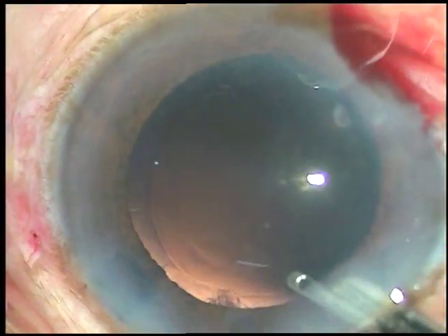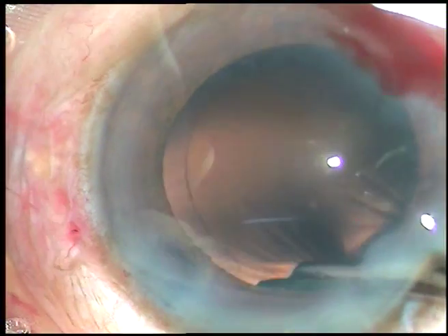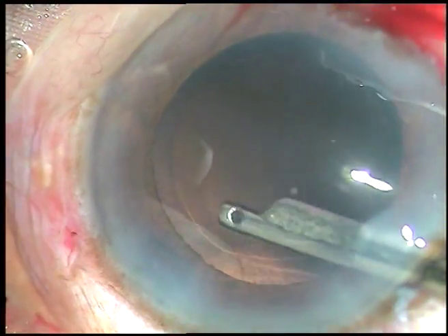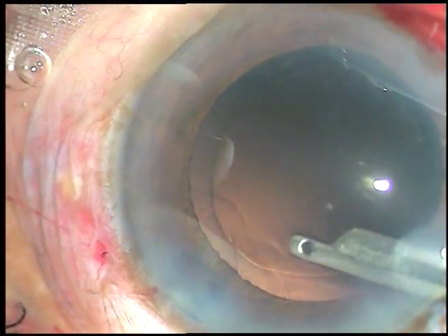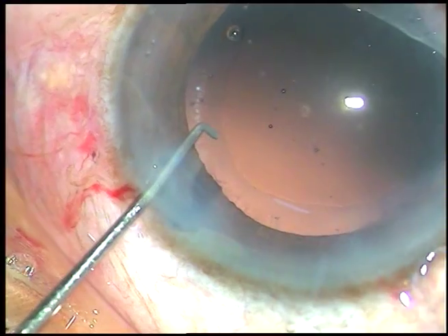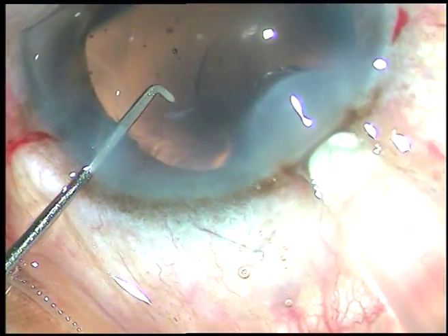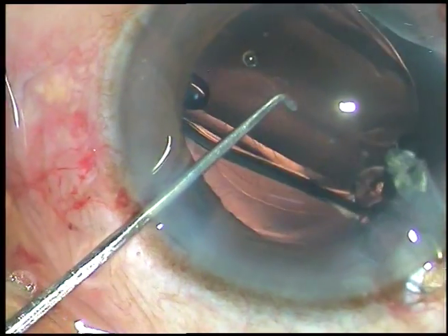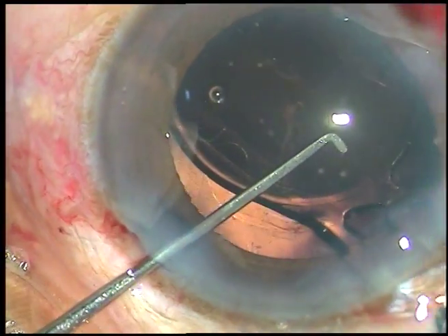After thorough removal of the cortex, the intraocular lens has been implanted using viscoelastic substance. Viscoelastic substance has been used in the anterior chamber and the capsular bag.